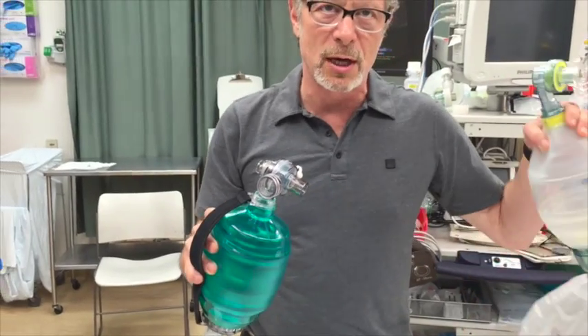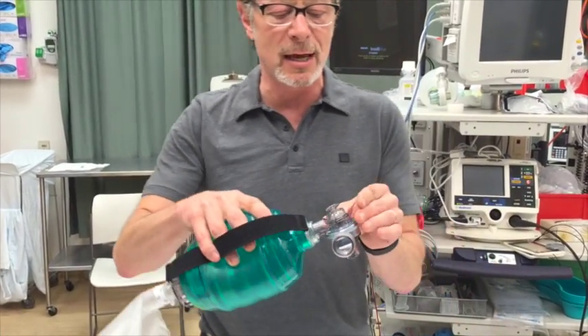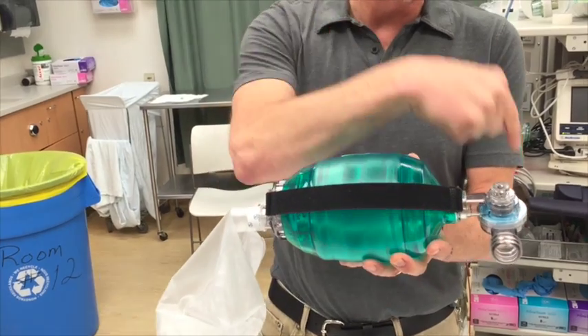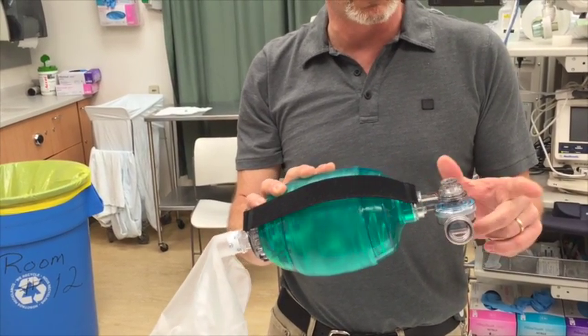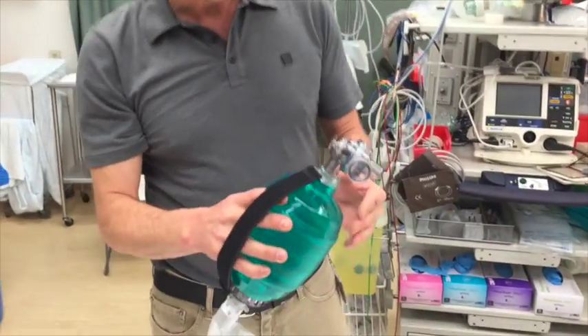The front end is where this really differs. As opposed to the Lairdell which has a duck bill valve and a separate expiratory valve, this one just has a single duck bill valve meant to give one-way flow to the patient, and to divert flow out through the expiratory port on expiration. Sounds simple — sounds good.